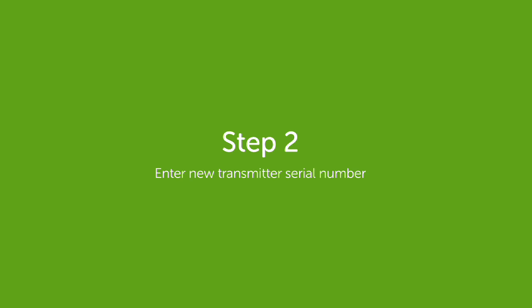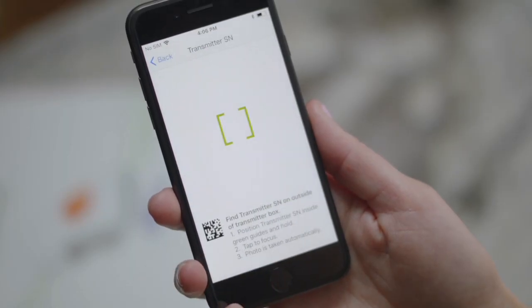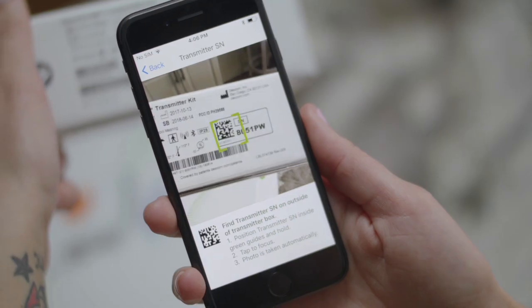Next, you need to enter your new transmitter serial number. The serial number is on the back of your transmitter box. You can either take a photo of the transmitter serial number or enter it manually. I will do this by taking a photo.